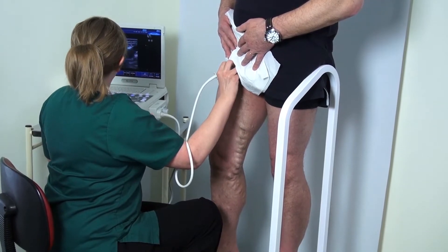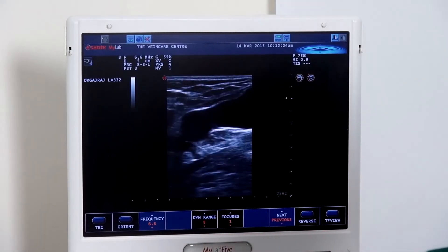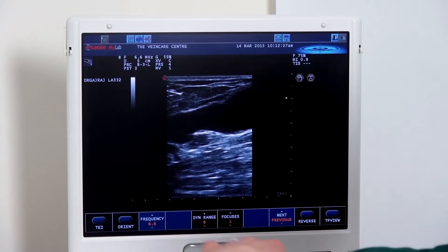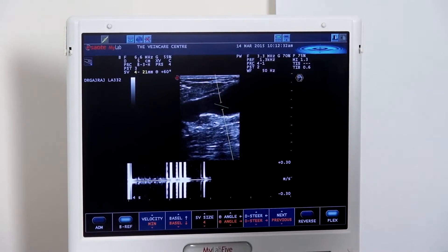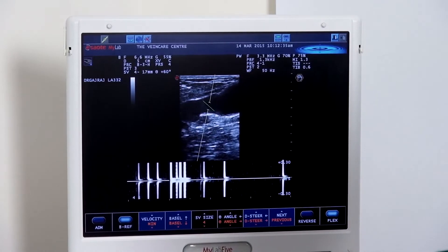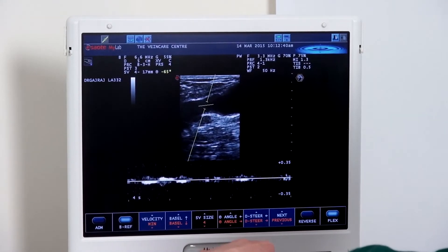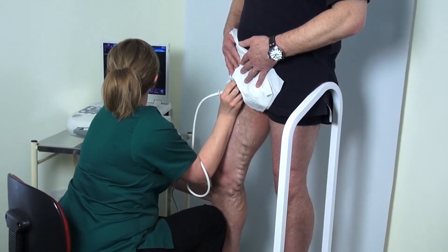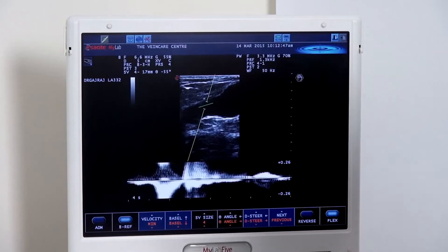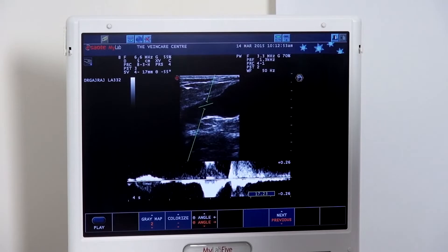Turning back to our Mickey Mouse sign, we pick up the saphenofemoral junction, turning into a long section. Again, we perform the same procedure — pop the pulse wave on. Again, the angle needs to be changed to meet the vessel walls. What we can see now is the initial squeeze and then a large reflux coming back after the squeeze, demonstrating incompetence of that vein.